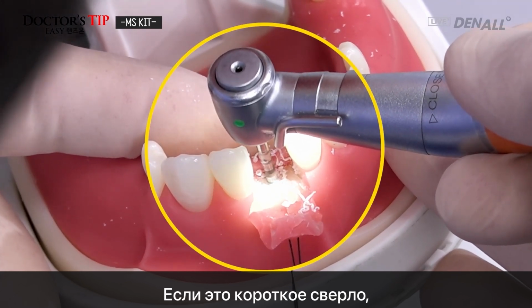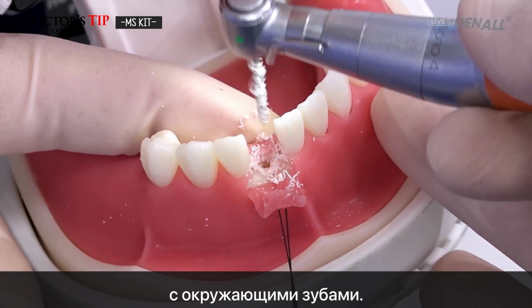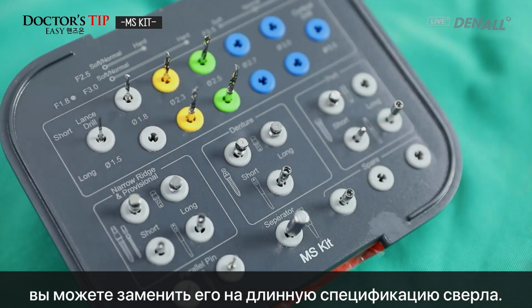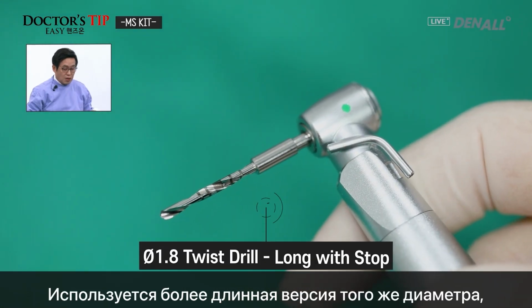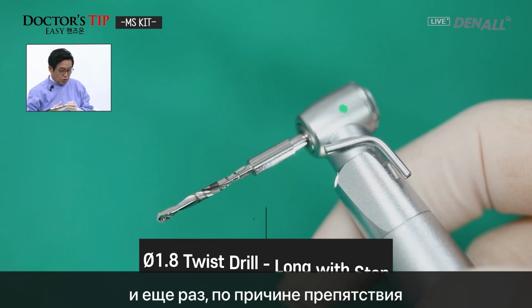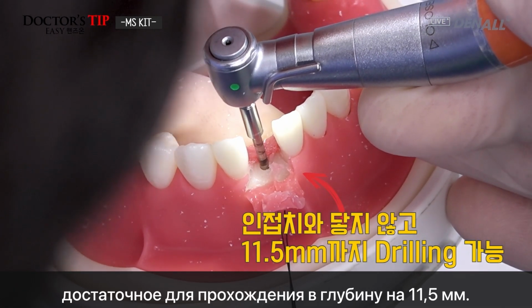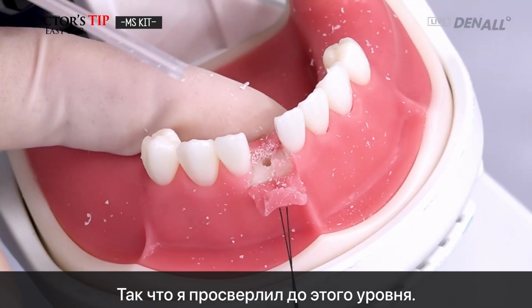If it's the short drill, there could be interference from adjacent teeth, and if you therefore cannot go to the full length, then you change to the long type, the long shaft drill. Same diameter, use the longer version. So it's a long with stop. And again, because there could be interference in the mandibular anterior, you use the longer version of the drill, and it's sufficient to go up to 11.5 millimeters. So I have it drilled up to that level.